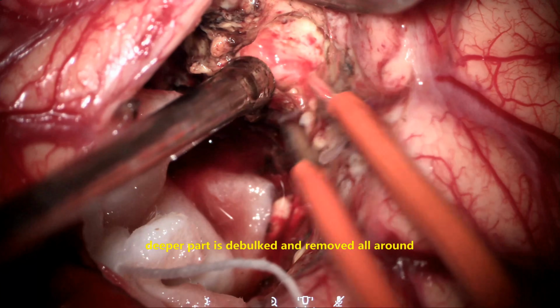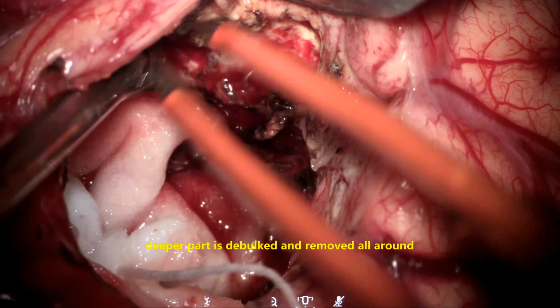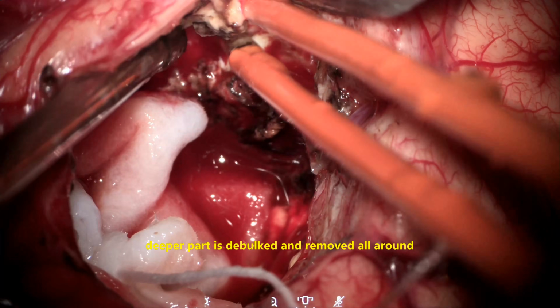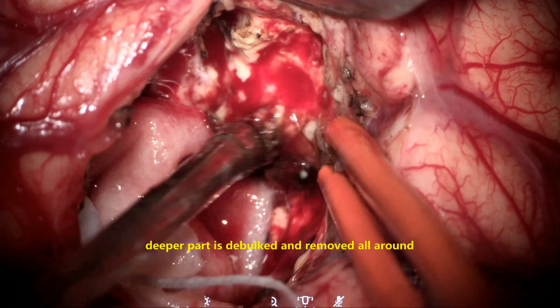Here appears to be the temporal region towards the insular cortex. There appears to be some tumor again that is decompressed and debulked till we get the normal brain, and the hemostasis is achieved, as I mentioned to you earlier.